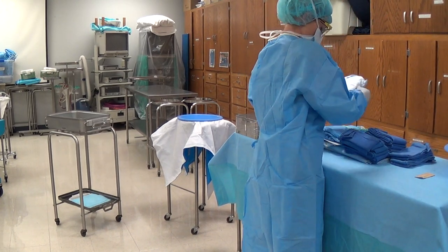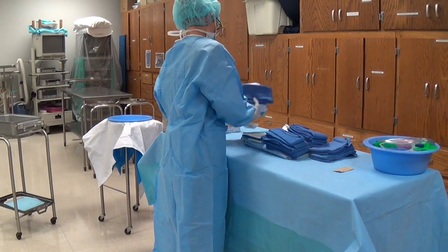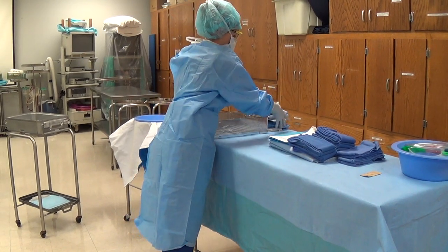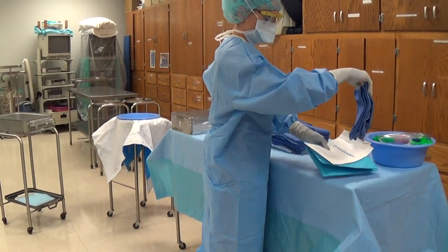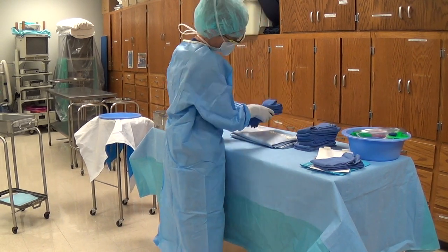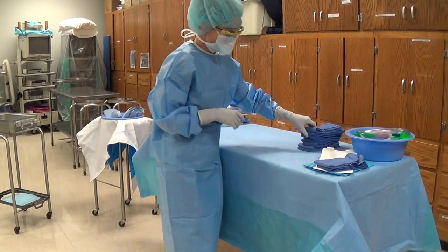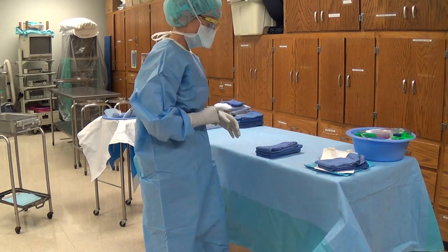Casey's going to start adjusting her gowns and gloves and towels. The whole point of setting up is to touch things once. Casey has these in her hand — she's putting the gloves on the bottom, gown, then towel, and placing them behind her instrument basket. Next, she's grabbing her mayo cover, her trash, and two towels, sticking them in the corner so that's ready to go to drape her mayo. She has four towels and her laparotomy drape. She's going to grab those and place them in her basin, pushing them down to make sure they don't fall out. She'll grab three towels to cover her back table, and the extra stack she's placing right next to her stack of gowns and gloves.